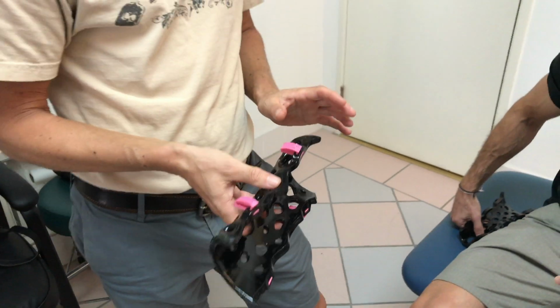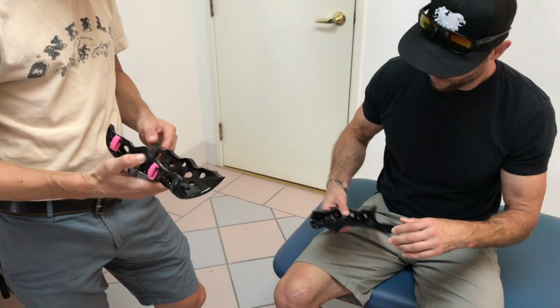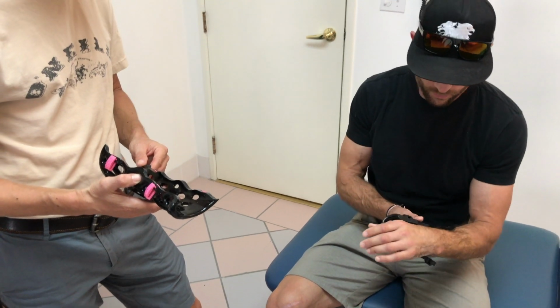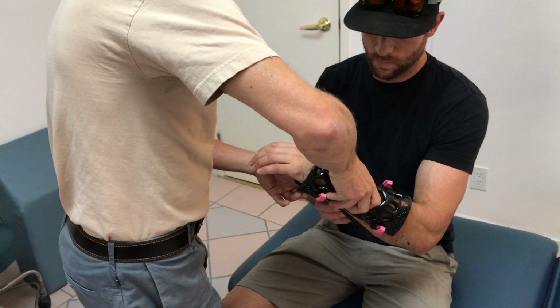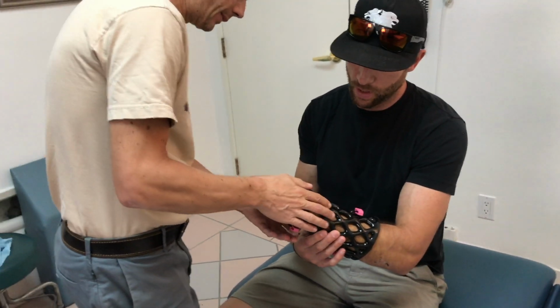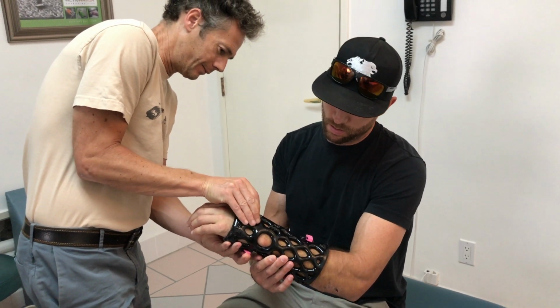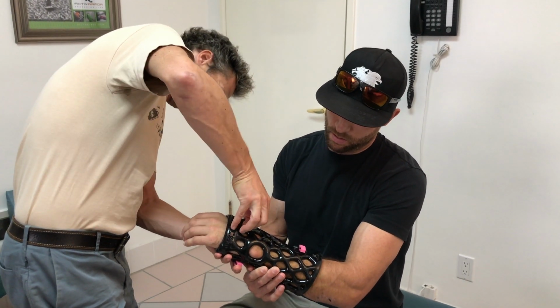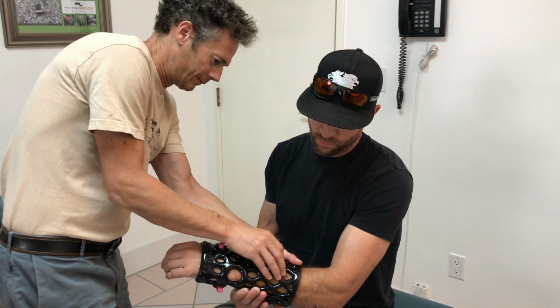Okay, so we're going to put it on and then we're going to push this through the hole. So go ahead and put that one on. Okay. So get it lined up. Snap. Oh, and it says Made in America.